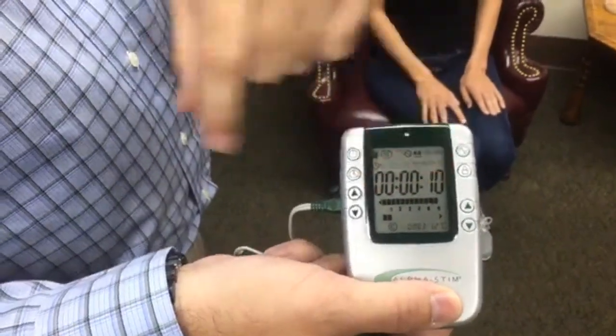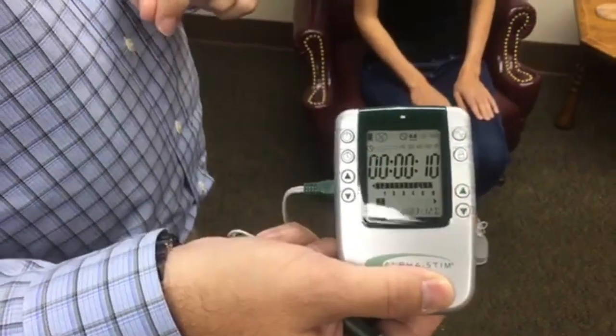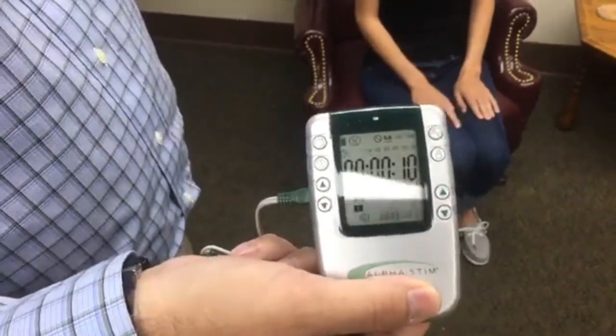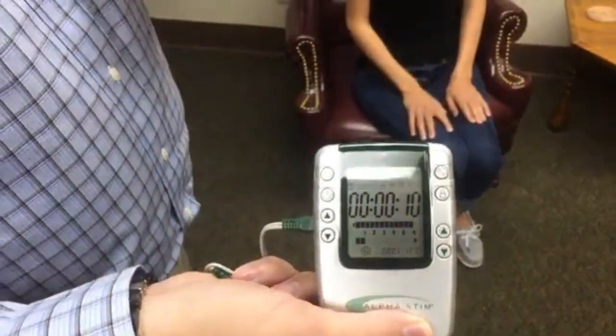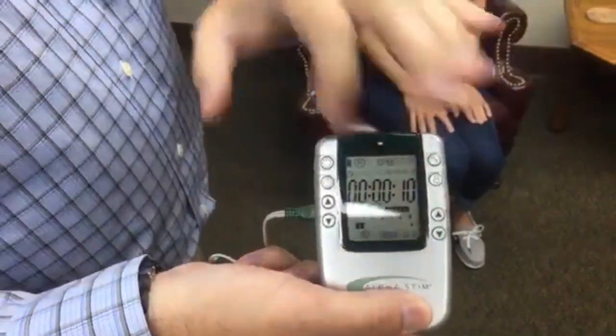Underneath the timer is our intensity. We have this device set to the maximum, which is 600 microamps. Most places on the body when you treat with the probes, that's subsensory — they don't feel really anything. As you get closer to the neck and the shoulder, or closer to the midline and the brain especially, you can get some vertigo. So as we treat Rachel, we'll ask if she has any vertigo or dizziness, and we can always turn that down.